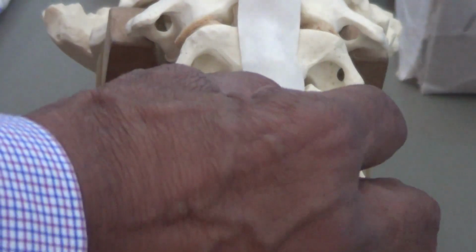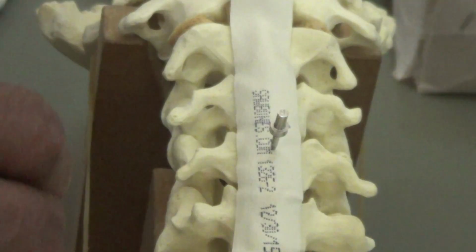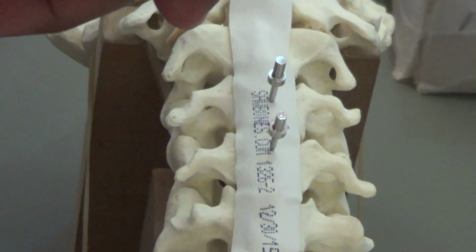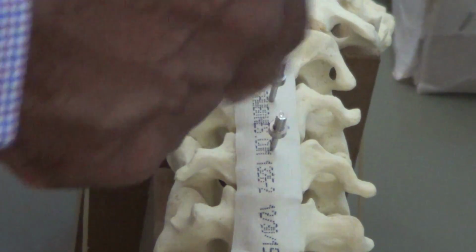You put a distractor in the disc below and the disc above. You put a pin first, with pins coming on either side of the disc, and then you put the distractor. Then you have a special clamp. Then you can distract, and after distracting, you excise the disc.